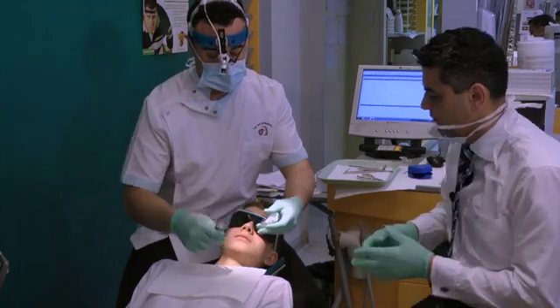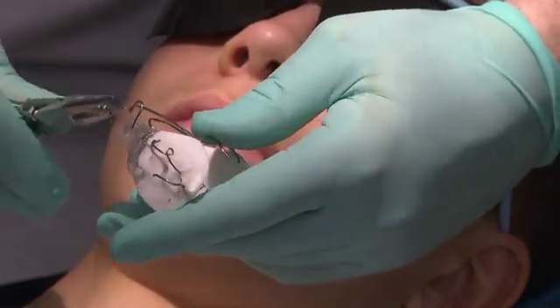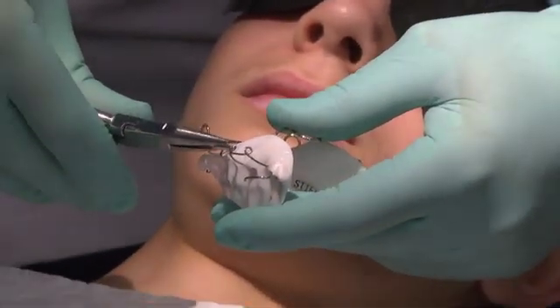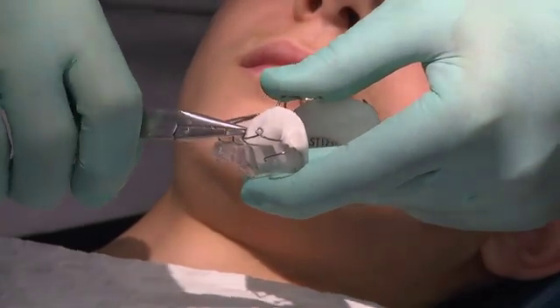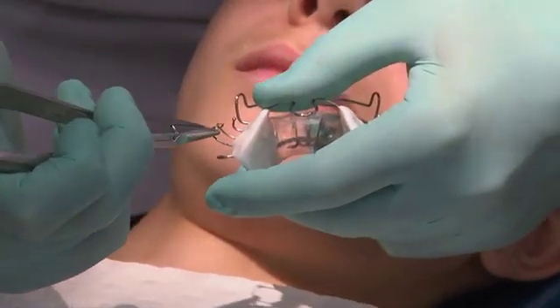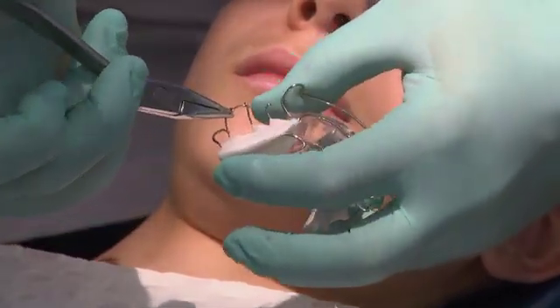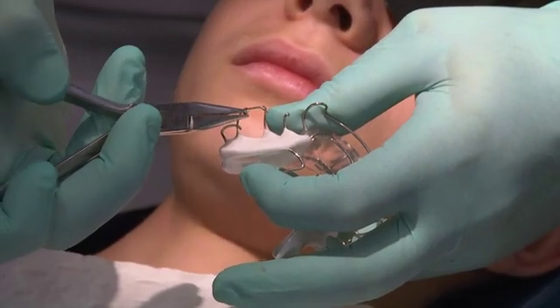To activate the omega loops, put your little bird beak into the omega loop. We get the omega loop and activate towards the undercut of the tooth, which will be gingival. We go into the omega loop, grip it, and roll it in. Then on the distal, do the same — activating in the gingival direction, thereby embracing the undercut a little bit more firmly.